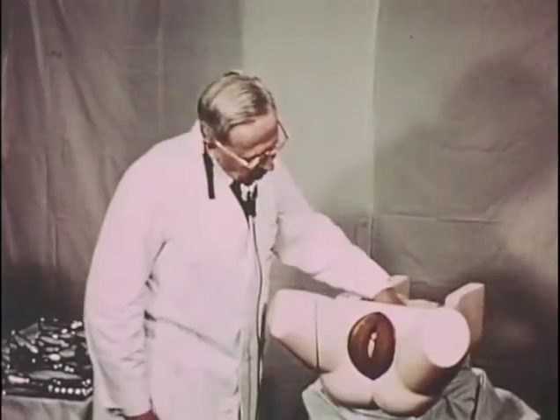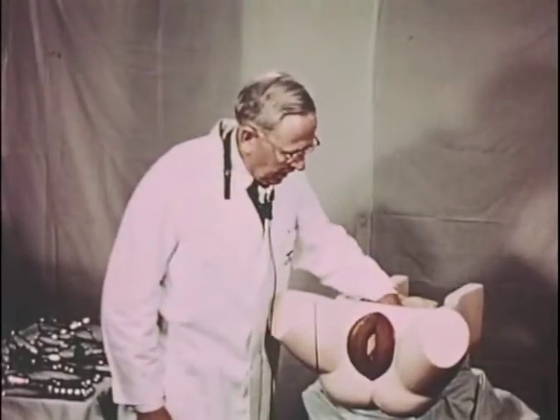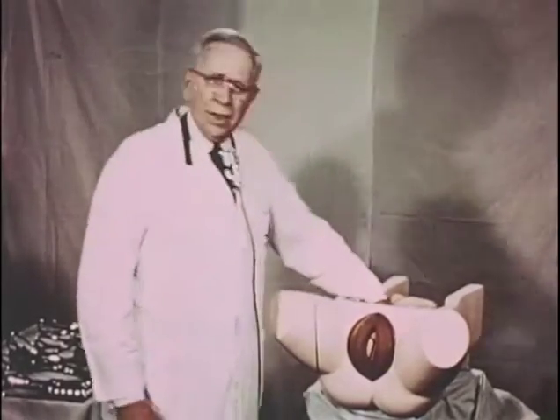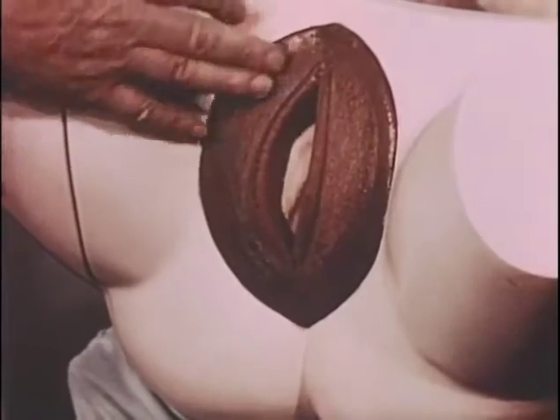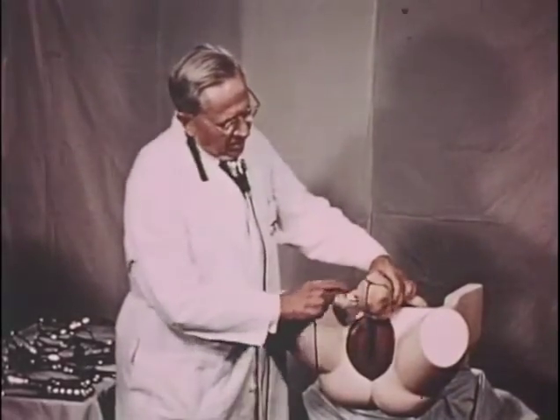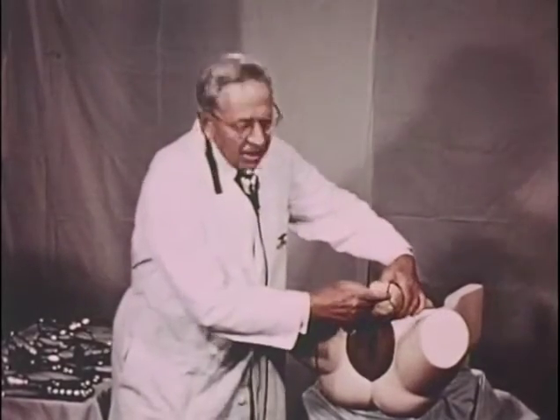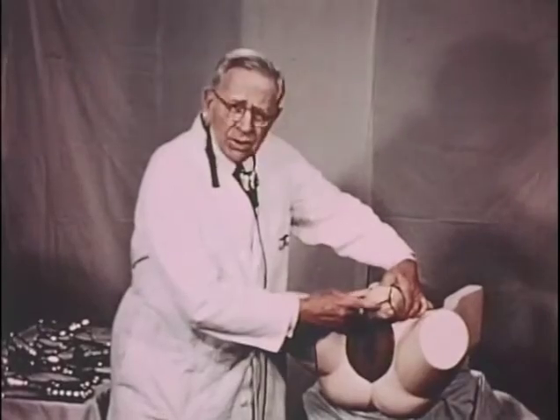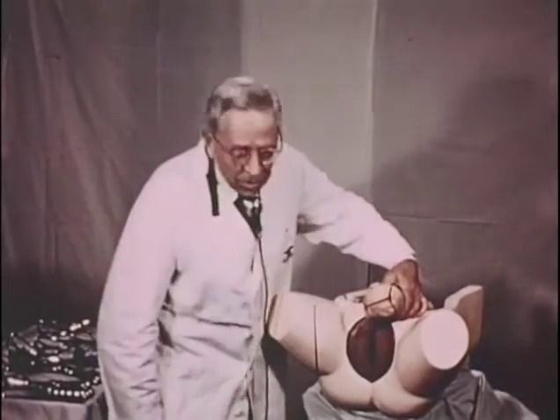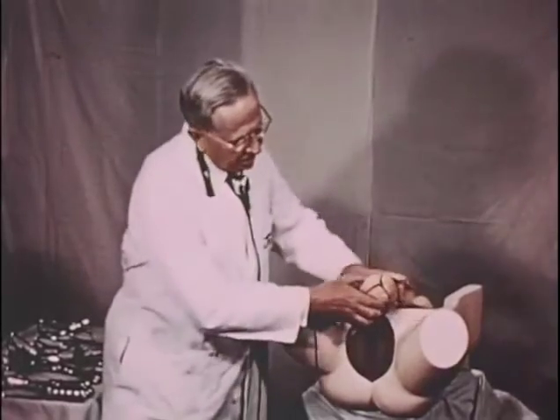A good anterior position. We register the degree of desirability of a good anterior position by its closeness to 12 o'clock. The further away from 12 o'clock that the posterior fontanelle lies, the less desirable is the location of the sagittal suture from the standpoint of being in an anterior position.